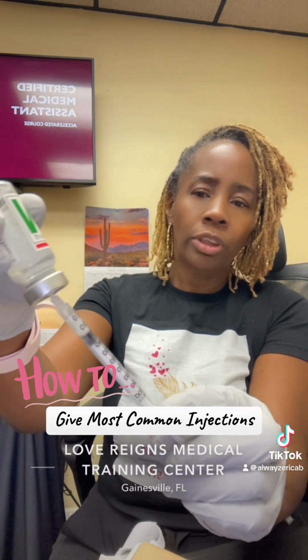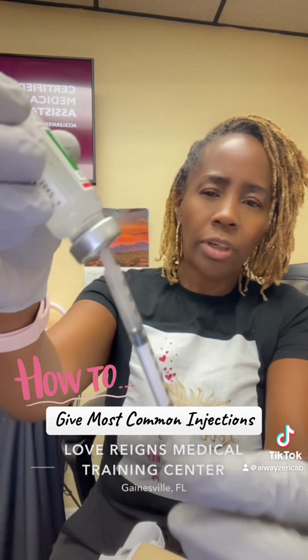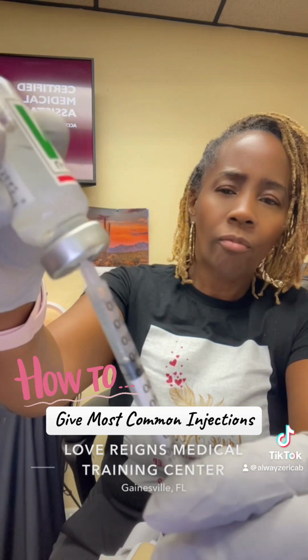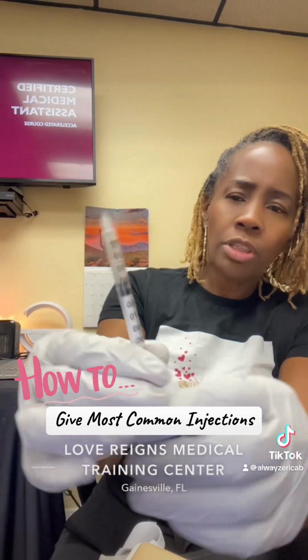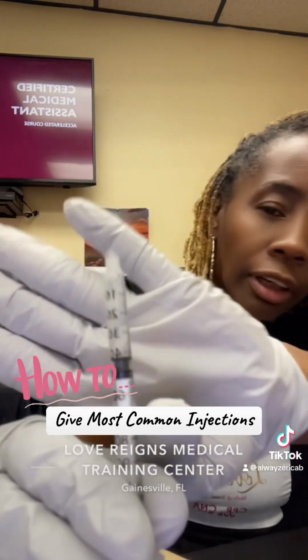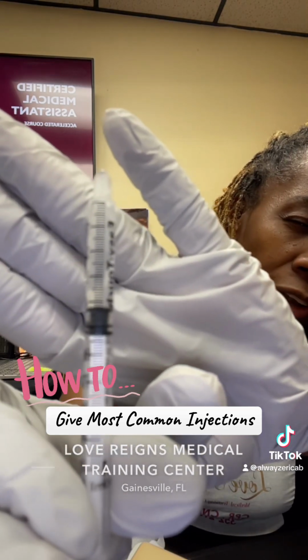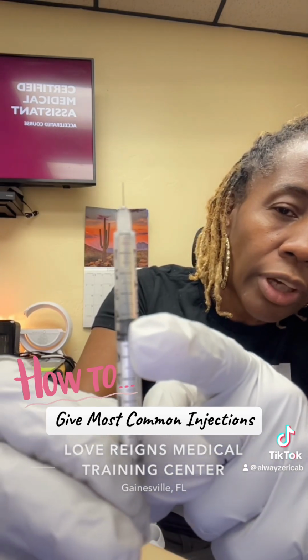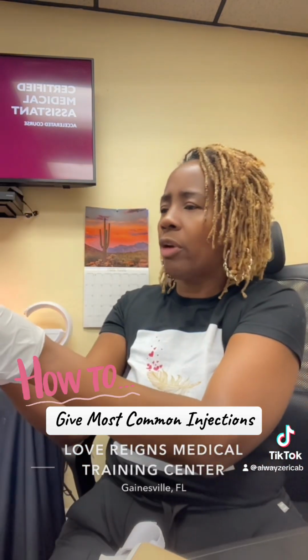And usually what we'll do is go back a little bit more over the 40 units just to be able to get excess air out, because you don't want to push air into your patient. So I'll probably, for the most part, go a little past the 40. And there's a little extra air in there, and I'm going to push back now. I don't know if you can see that I'm a little below the 40 line. Can you see that dark line right there? That's where I want to be, on that line right above that plunger. So I'm going to push that out so I can be right at the 40.